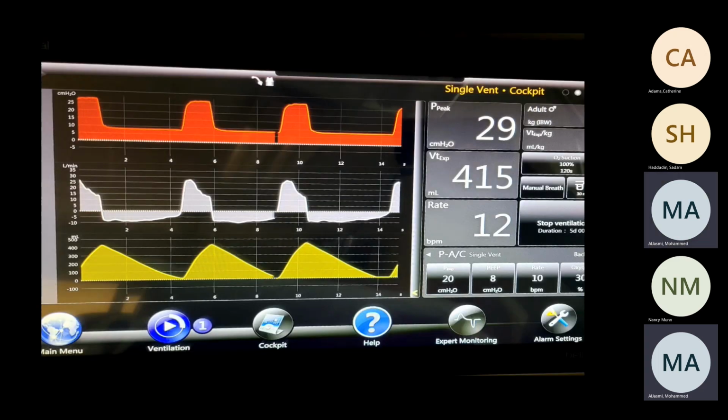It's important to know what kind of desynchrony this is, like early cycle. What we'll try to do is, if you can help me, guys, if you have anyone with desynchrony, just take a picture of it, and we can have a discussion about it. We'll try to bring early and late cycle, early and late trigger, PMUS, high elasticity, double triggering, and failed trigger.